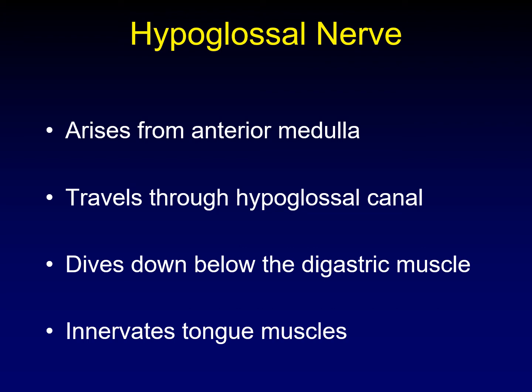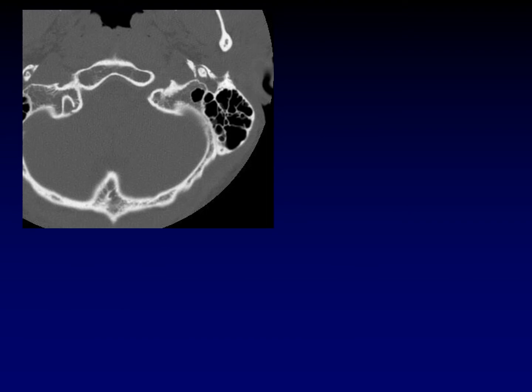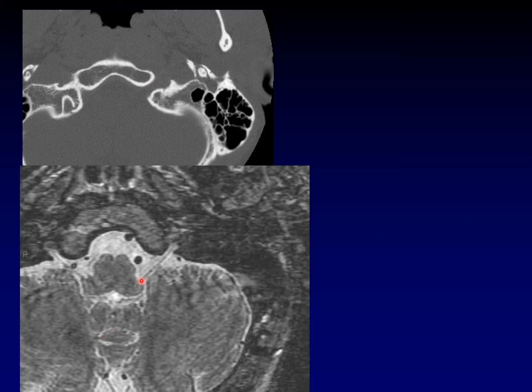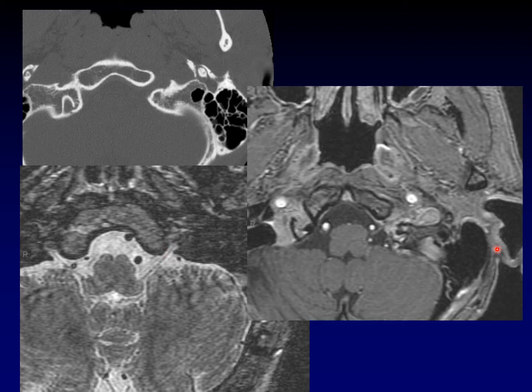Once the hypoglossal nerve reaches the oral cavity, it is responsible for innervating the muscles of the tongue. On CT, the hypoglossal canal is lateral to the clivus with nice cortical surfaces on either side. On normal MRI, the hypoglossal nerve comes off the lateral medulla, taking a 45-degree oblique course through the lateral medullary cistern until it runs through its own canal. On post-contrast imaging, that same 45-degree oblique course is visible, with the nerve running through the hypoglossal canal surrounded by normal venous blood.